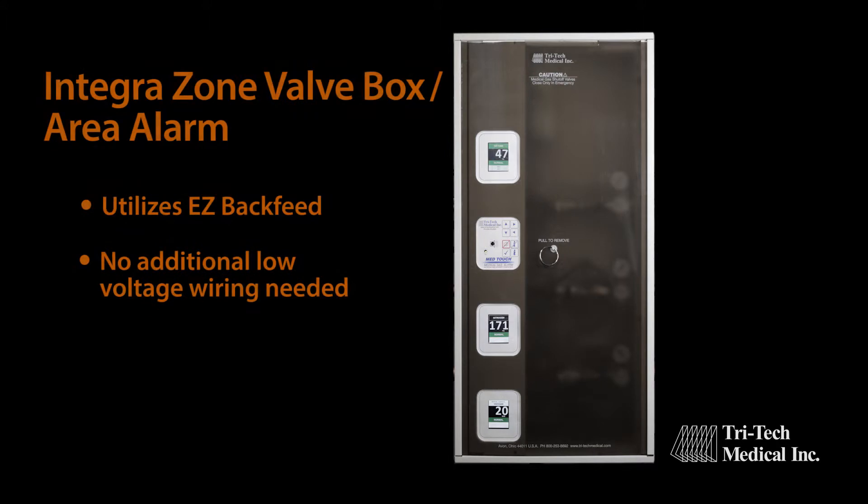The Tritec Medical Integra combination zone valve box area alarm utilizes the Easy Backfeed to locate the alarm transducers in the valve box alarm, completely eliminating the need to do low-voltage wiring in the field.